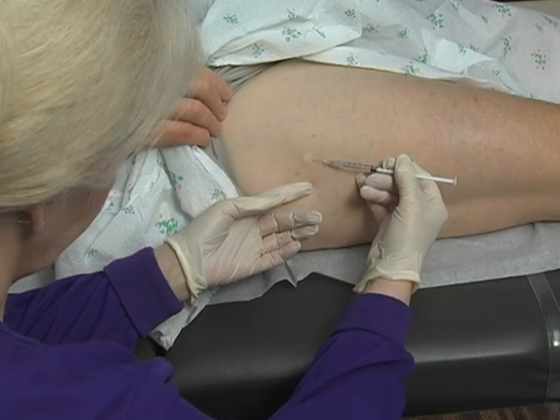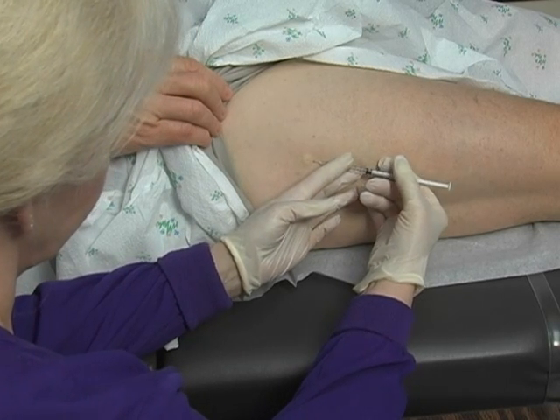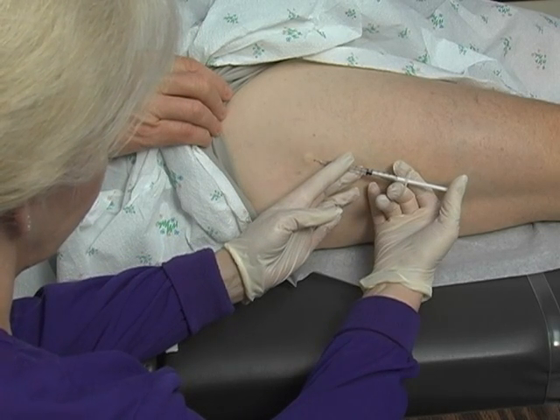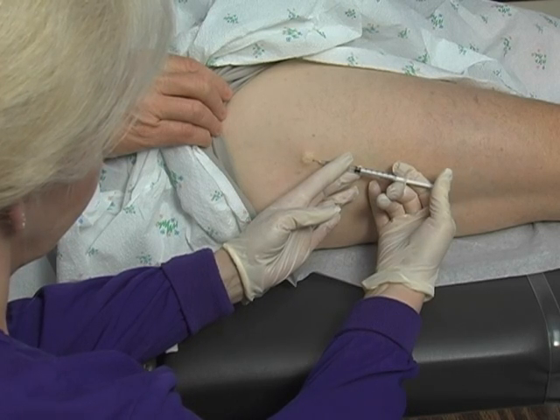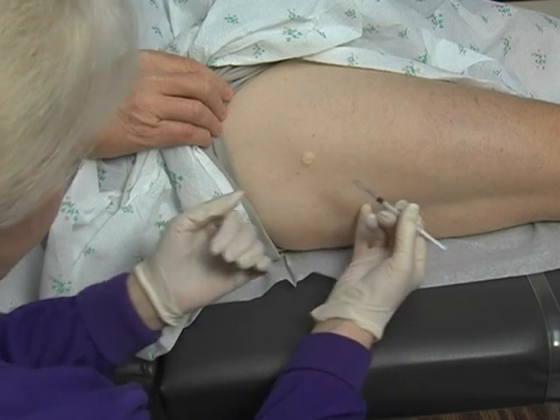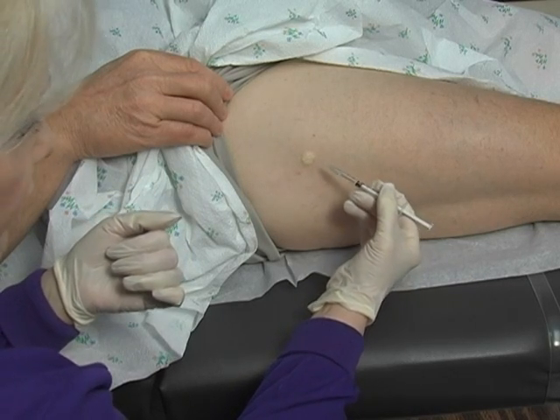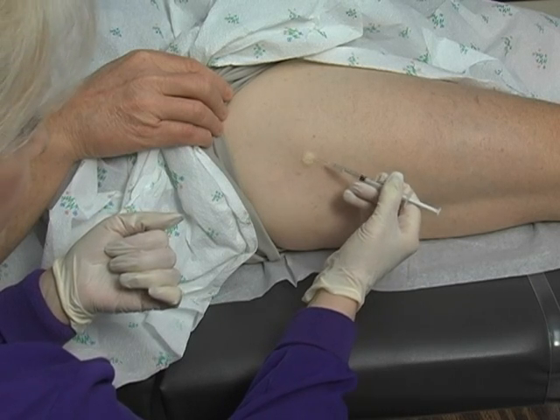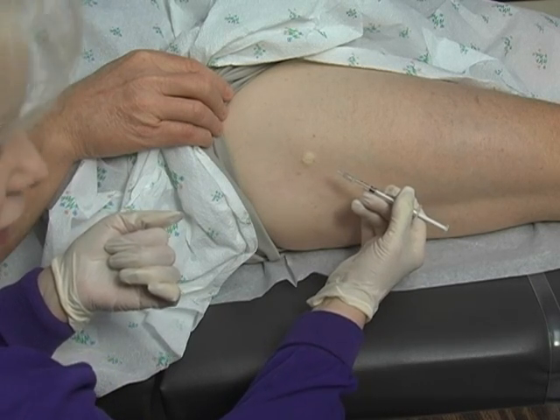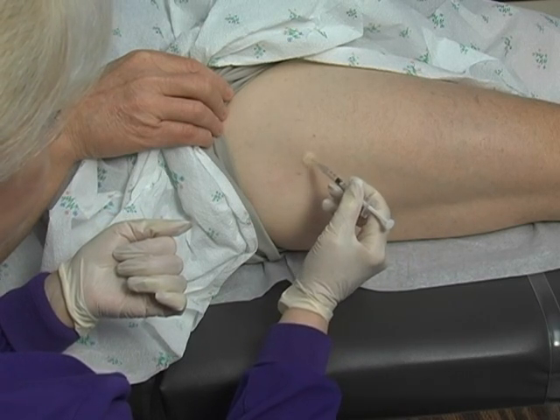Let me go ahead and inject a little bit more then. What we're looking for is a nice little bleb — that will be our actual biopsy site. We don't want a biopsy right over the tract where we injected the lidocaine, but you can always test to see if they're numb.